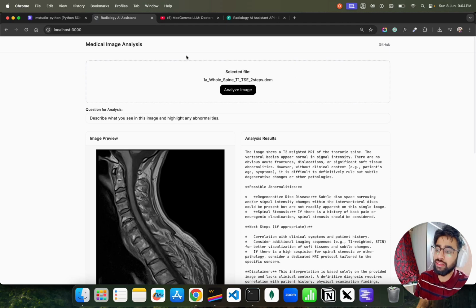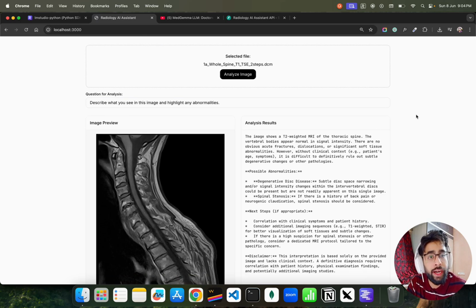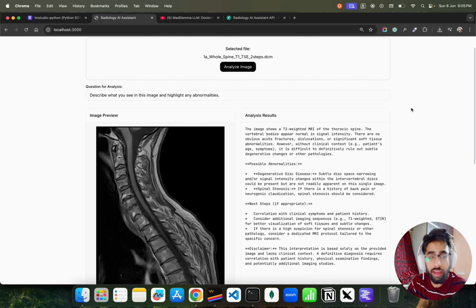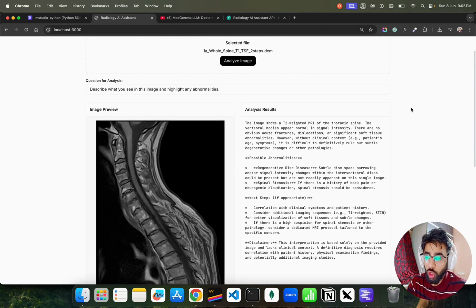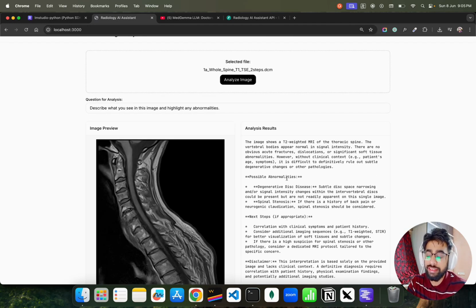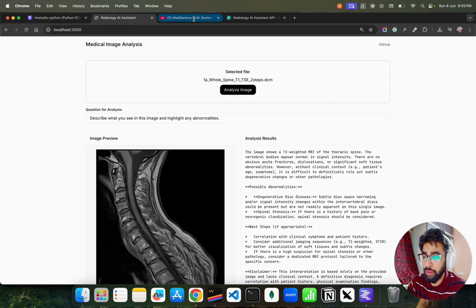We're going to build this radiology AI agent that's going to help radiologists find anomalies, perform segmentations on the given images, do information discovery or find similar case studies from PubMed or NCBI or wherever we can access, and a lot of other things that we can do on top of it, like finding out priorities and risks. So this will follow up in the upcoming videos.